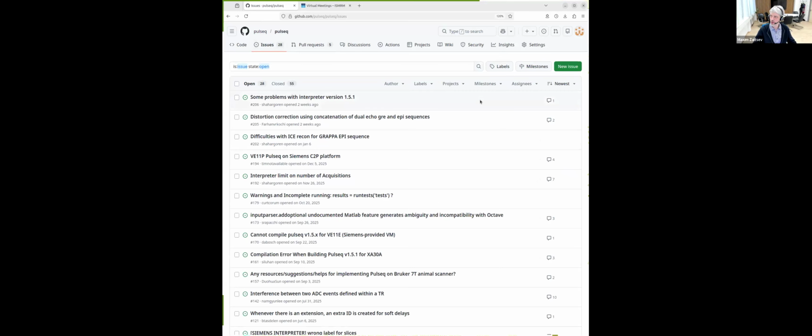By the way, we are facing this table undocked issue now and again. It's Siemens specific, and it happens on the recent Numaris 10, Numaris X systems, where you suddenly get this message box that your table is undocked. That happens on both of our scanners, which have fixed tables, so the table cannot be undocked.